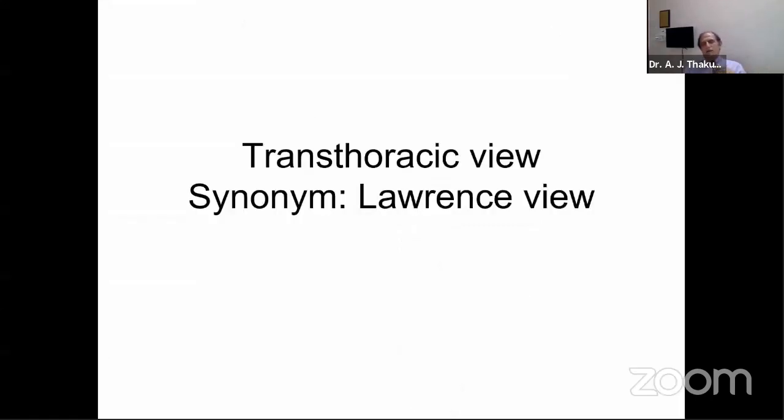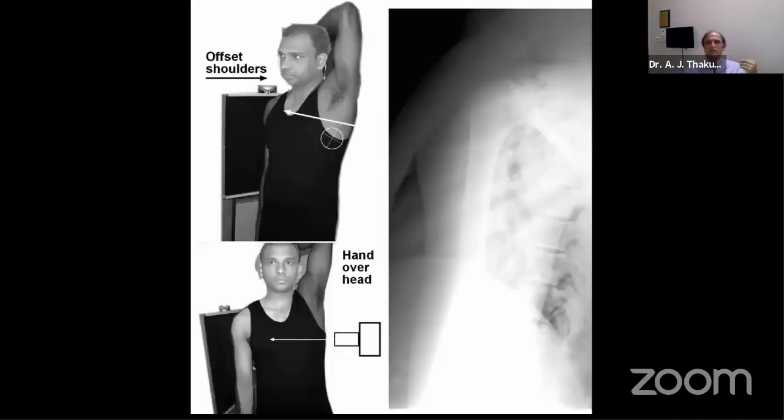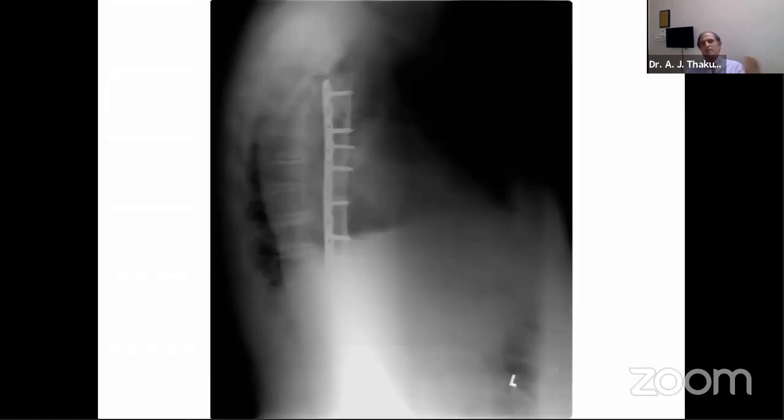When the arm is strapped to the chest wall and we don't want to move it for some reason or another, or our patient resents it, then without disturbing, you can take the Lawrence view, which is transthoracic. The sound hand is lifted up and this is shot straight away through the chest wall, and we get a picture something like this. In this position, AP is very easy, but transthoracic will save the day for us. When there is a plating, one can see all the possibilities there.